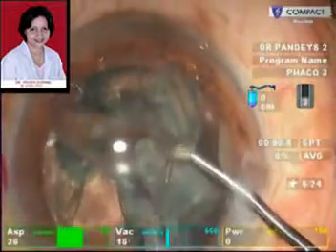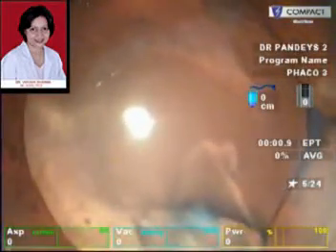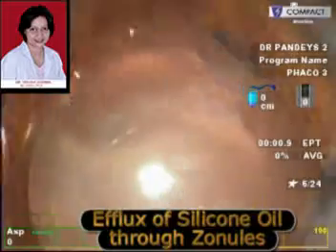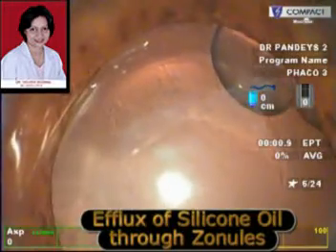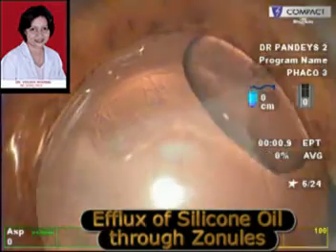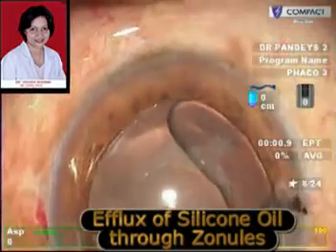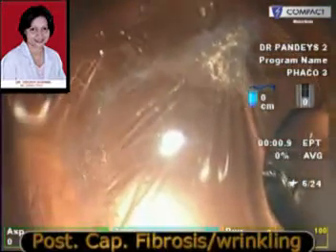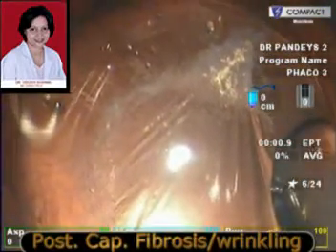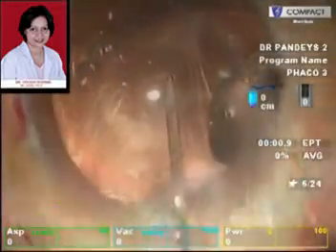Once the cataract has been removed, as we can see here, there is fibrosis of the posterior capsule, which commonly occurs in cases that have had silicone oil. Here we can see the efflux of silicone oil through the zonules. As we can see, because of the hydrostatic pressure the silicone oil tries to come out into the anterior chamber, and once we make a posterior capsule opening it will easily flow out into the anterior chamber and out of the eye from there.